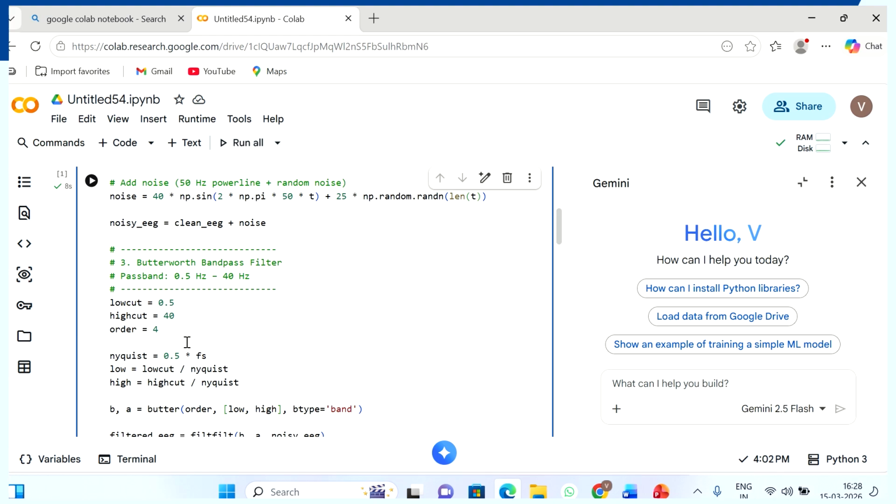And the Nyquist frequency is equal to half of the sampling frequency. Sampling is applied for converting the analog signal to digital. So for digitalization, the Nyquist criterion should be fulfilled for the sampling process.